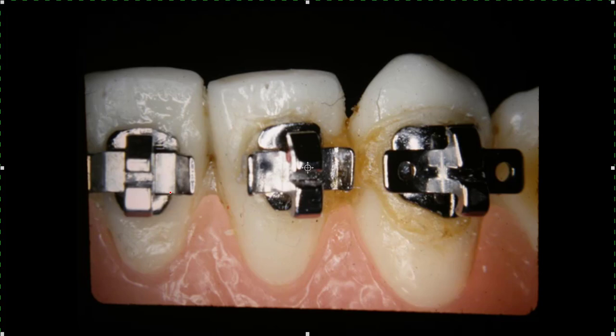Looking straight down on the cuspids - these brackets are nice. I do want to say one thing: I was using them all the time and you do get food underneath these wings, and we didn't have good sealants, so over a period of time you'd get some decalcification under the wings. But they've got such good sealants now - you go in and put the sealant on and then bond the bracket over the sealant. A toothbrush doesn't hit it very well in here when you've got a wire across. But once you've got a good sealant in there, these wings don't give you any trouble.